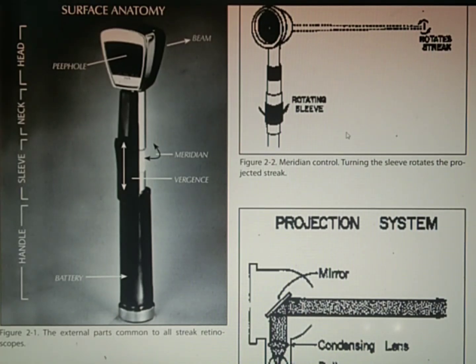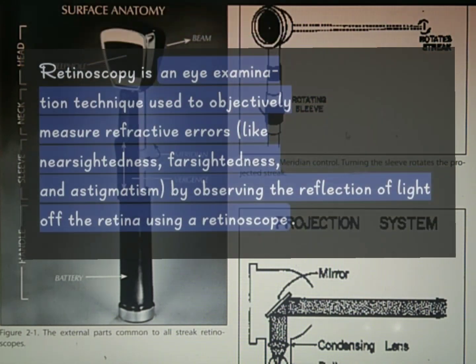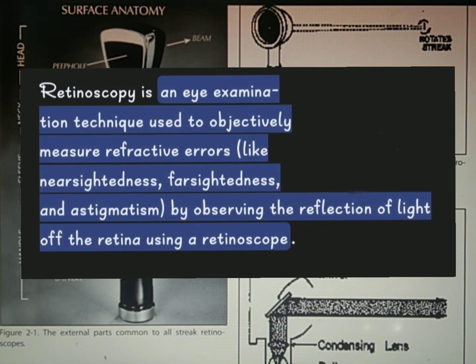Hi, I'm an optometry student and I'll be telling you about the retinoscopy. So, retinoscopy is an objective method to determine the refractive error of the eye.